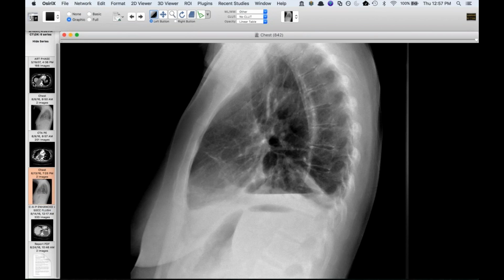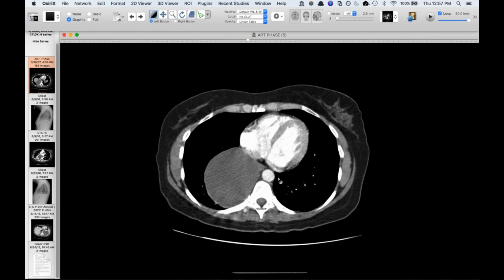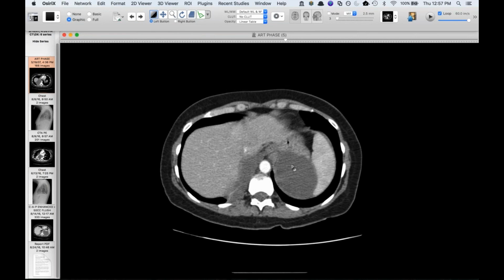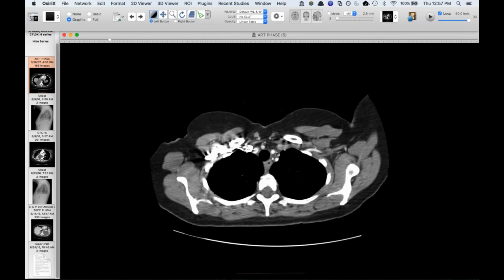What'd you say, Jeff? Ever have pancreatitis? Never pancreatitis, and that comes into play. And so here, you can see her esophagus. This is in 2007. She had this big multi-lobed cystic lesion that goes into the upper abdomen, traverses the diaphragm right here, and had never had pancreatitis that she knew of, never had anything.